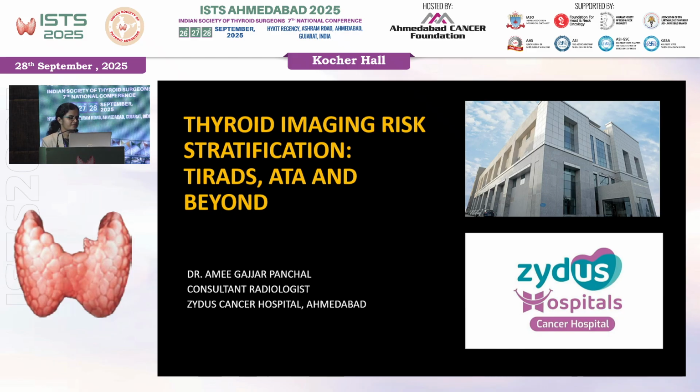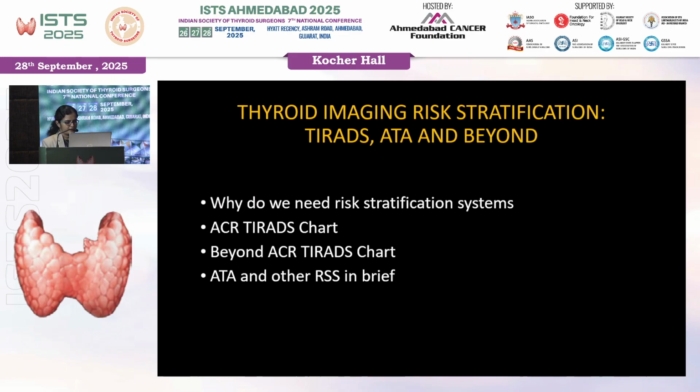Today my topic is going to be on thyroid imaging risk stratification. I'll be covering TIRADS in detail, and then we'll be looking at the ACR TIRADS chart, what lies in TIRADS beyond the chart, ATA and other radiology risk stratification systems.